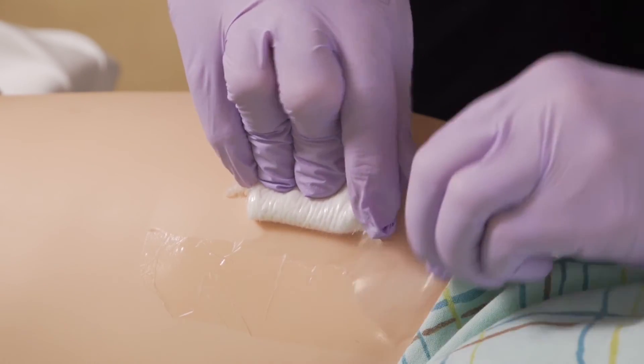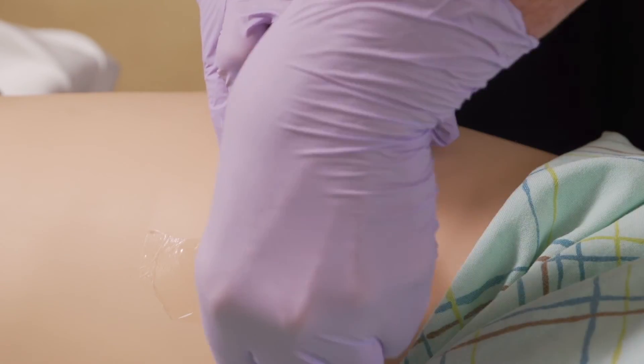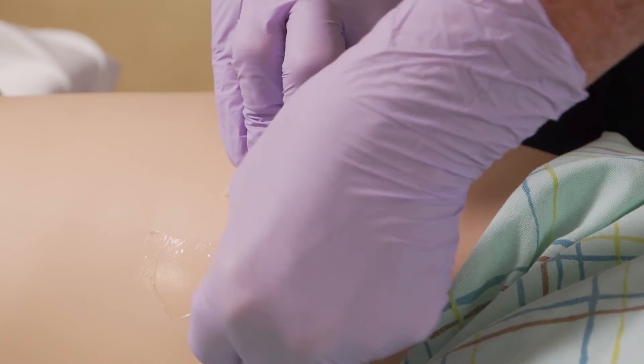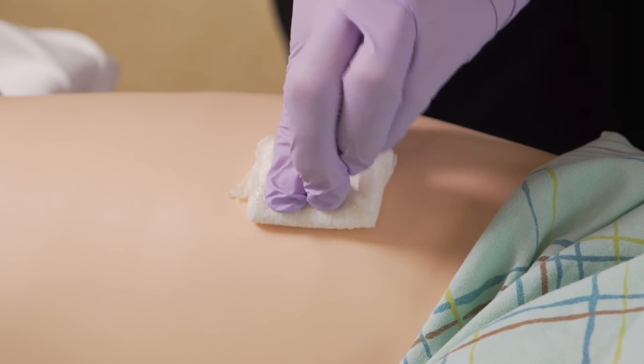Instead of pulling the Tegaderm off like a band-aid, hold the skin taut and stretch the Tegaderm to assist in its removal. Hydrate QuickClot with sterile saline or water to aid in removal without disrupting the clot.